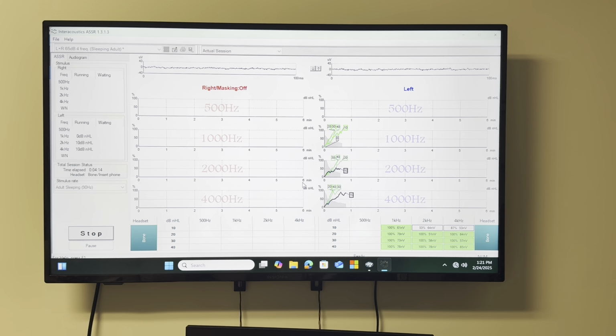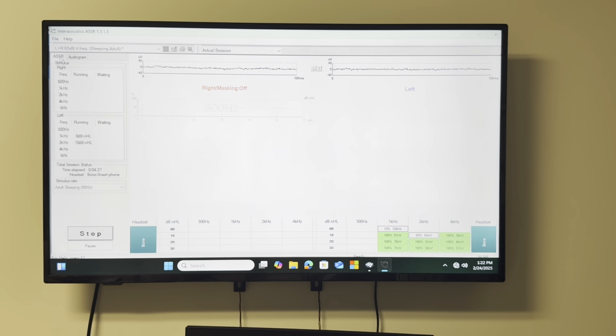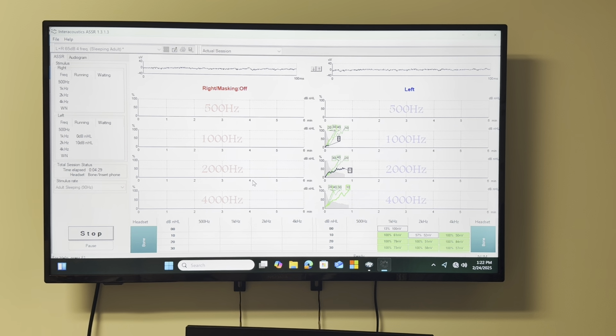But normally if we close the gap, we don't have to go beyond 10, right? It's already normal hearing. If it already has an audiogram, you can go and check. It doesn't have normative data, so that's why it's plotting those actual thresholds.